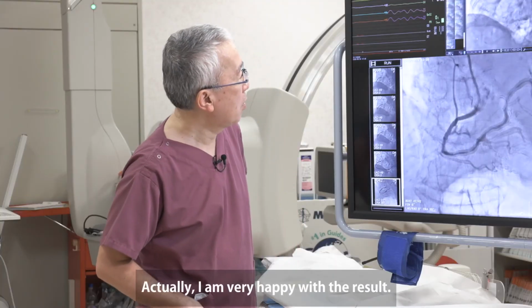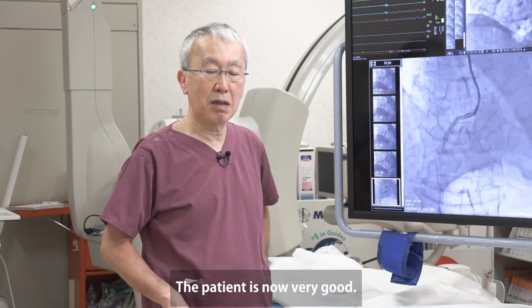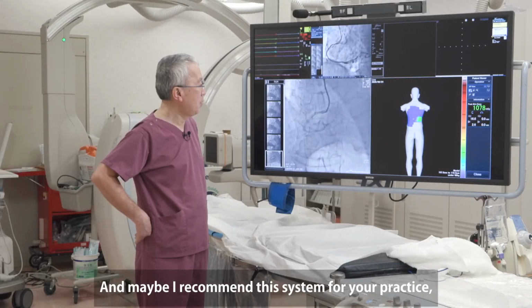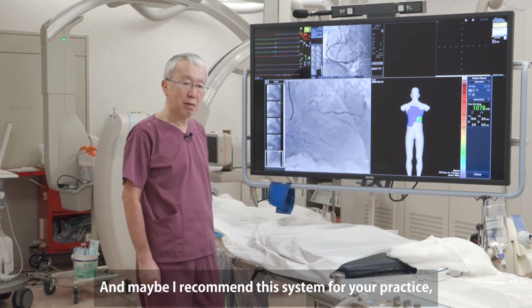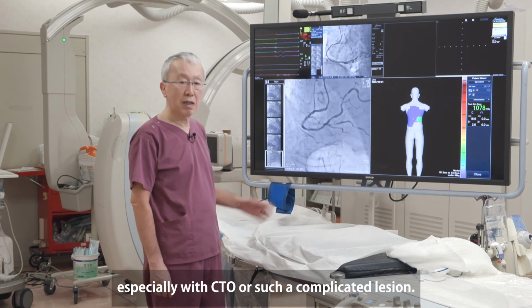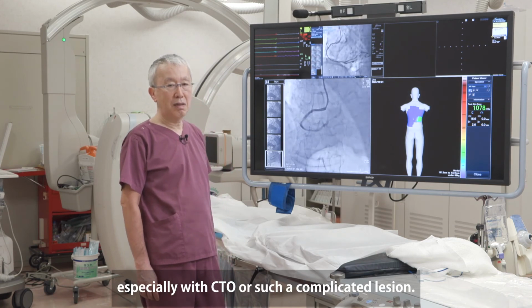And I am very happy with the result, and the patient is now very good. And maybe I recommend this system for your practice, especially with CTO or such complicated lesions.